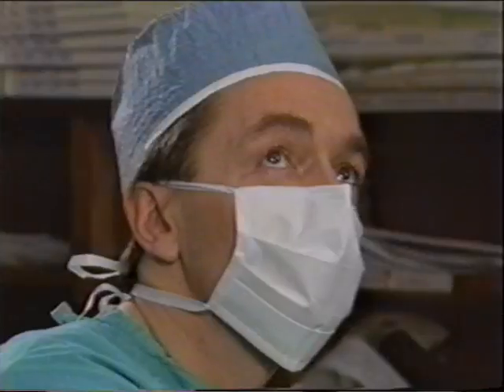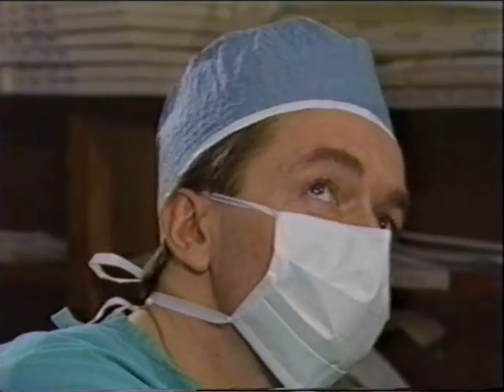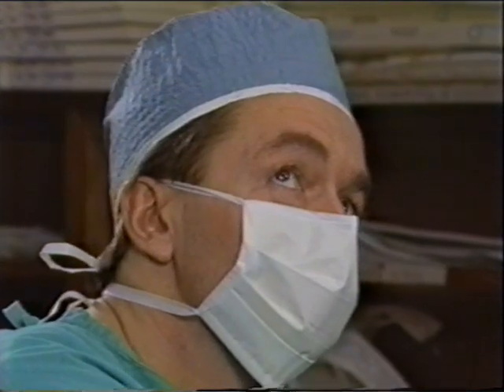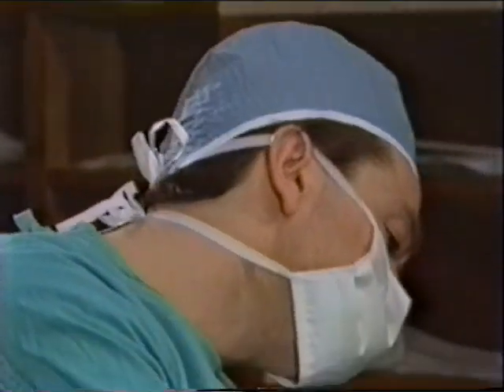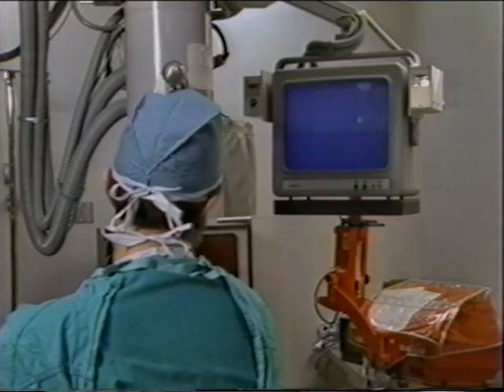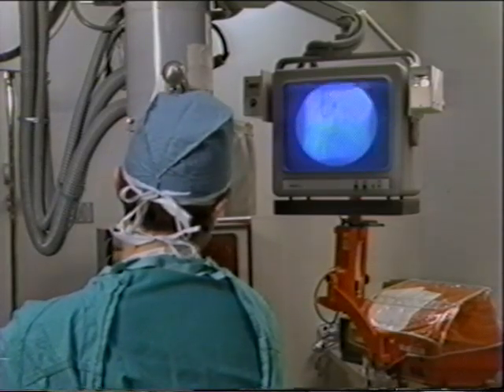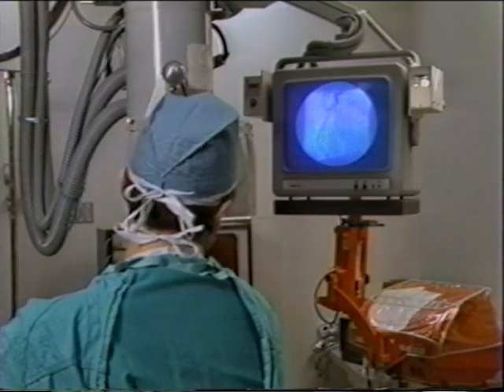Any blockages or narrowing in these coronary arteries will show up as dark areas within the coronary arteries that are outlined in white. Your cardiologist will take movies of these X-rays. After the procedure, he can study them carefully to determine which, if any, of your coronary arteries may be narrowed. Also, the size, shape, and motion of the heart chambers can be visualized by this method. This is called the ventriculogram.